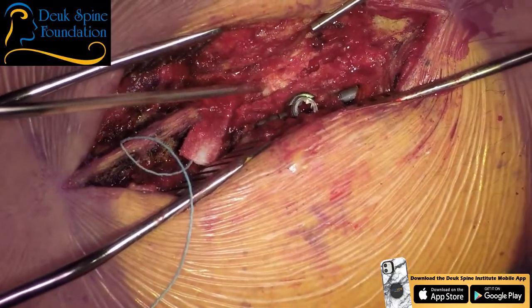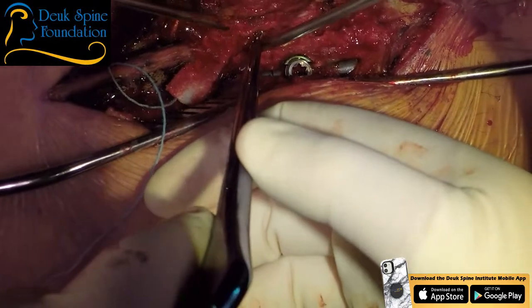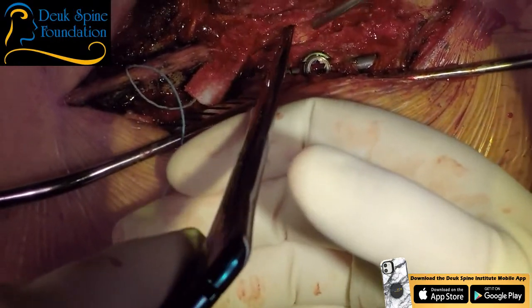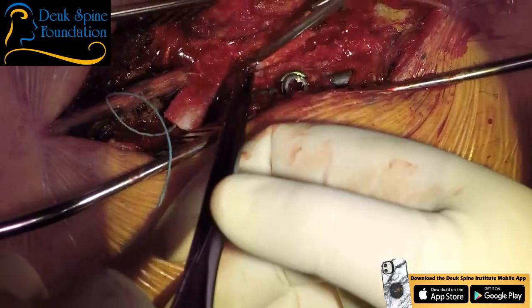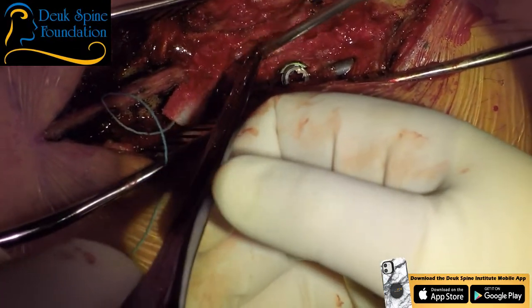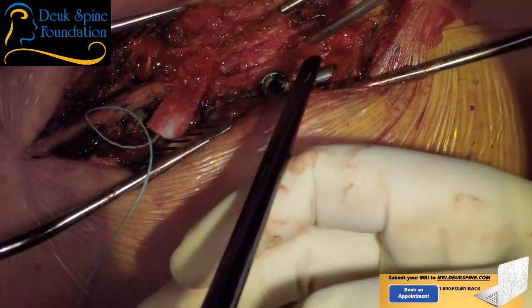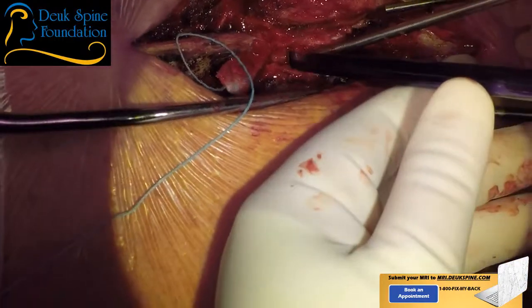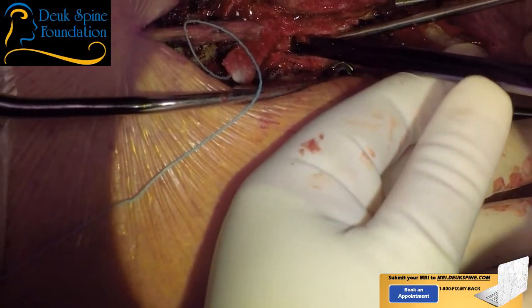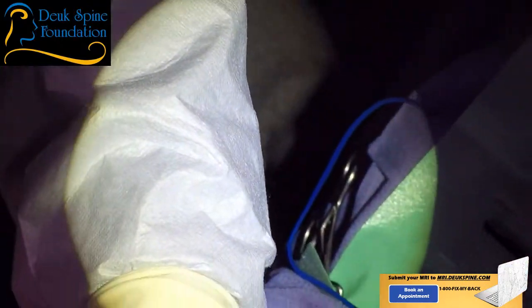Kerrison 2. So, for the surgeon, it's a balance between, help me, I can't see here. See, all this is what I freed up. Beautiful. Kerrison 3. It's a balance between removing bone to unpinch the nerve or spinal cord versus destabilizing the spine. Oh, yeah. That's a good bite. That's a good bite. So, a lot of spine surgeons don't understand that balance. And they just go crazy and take bone, take ligament, take joint.